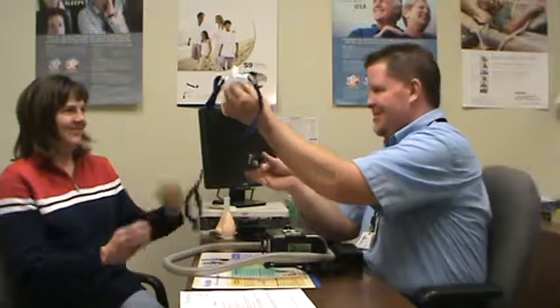The last option I'd like to show you is the fasteners. They're very simple. There's a receptacle on each side of the mask. Each receptacle has a clasp, and all you do is slide that clasp into the receptacle to attach it. You can hear it click into place. To release it, you just grasp the clasp on either side, pinch, and remove. Do you understand? Mm-hmm. Can you show me? Sure.